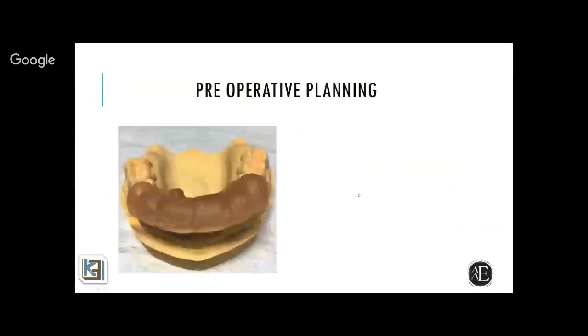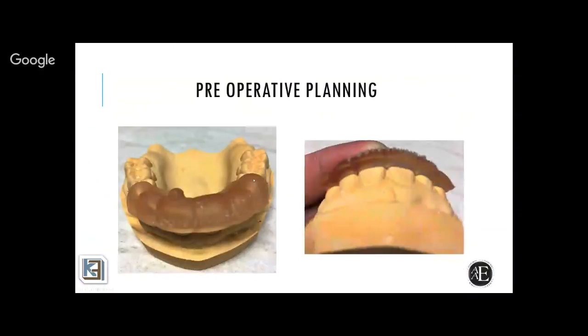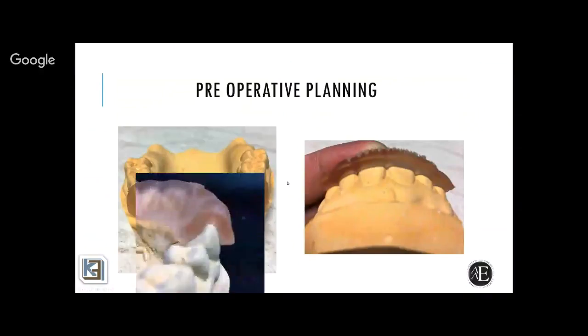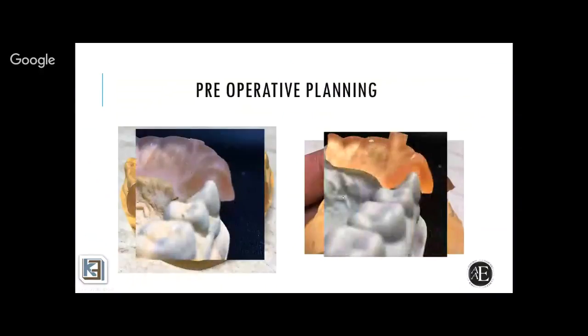So what I did is I created the surgical guide and I verified its fit, just like we do with implants. These 2 pictures would show the fit of the same guide on the model and on the resin model, and it's pretty accurate.